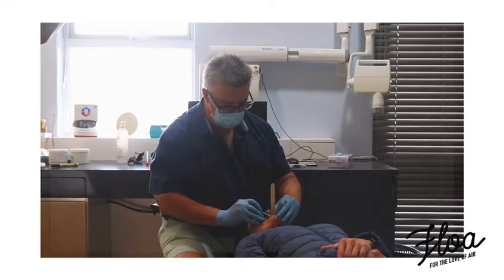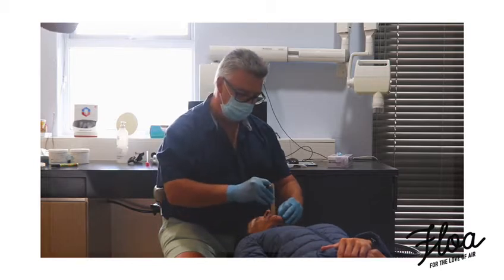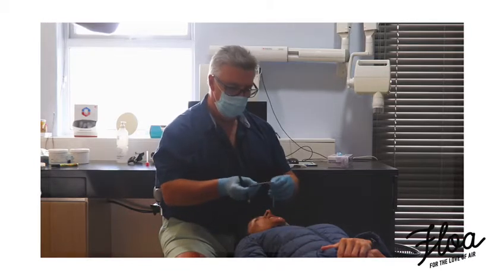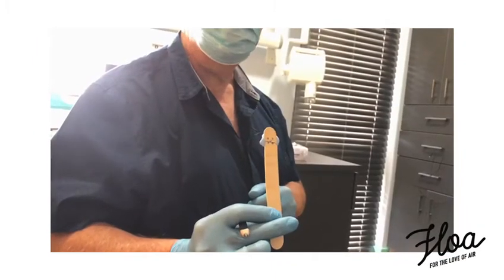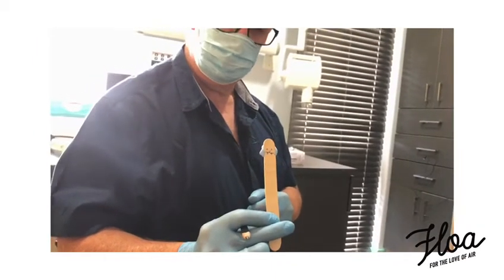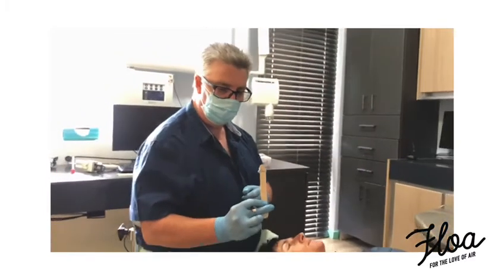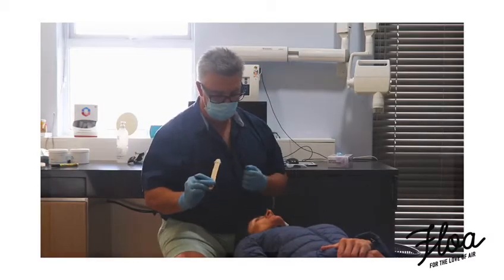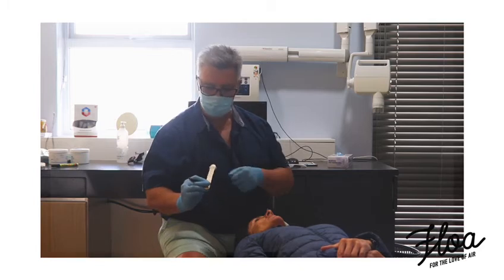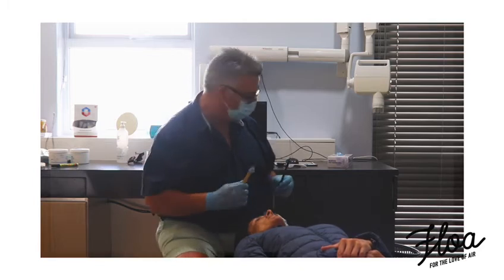That's why we put the stop on the bottom teeth — so that I can make a pencil mark there. Open for me. So there we have our little mark on our stick, and that's where the snoring sound diminished the most. We've got a fairly good idea — it might not be perfect, but a good idea of the amount of translation we need in that mandible. We also need to look at and see how much actual opening we need.